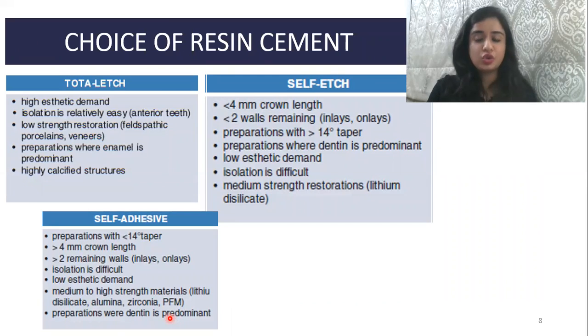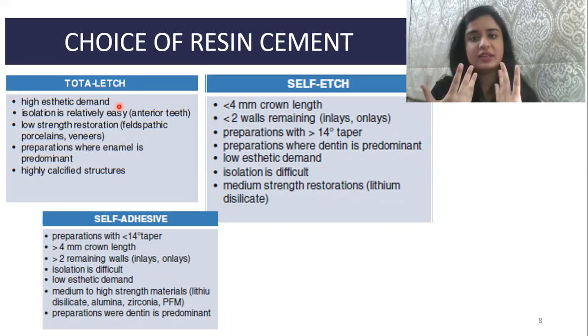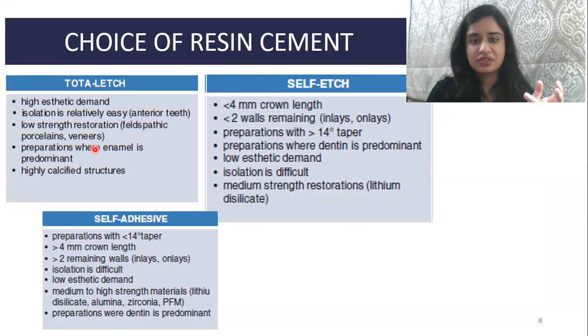Right. Now coming on to the choice of resin cement. So total etch, when there is a high aesthetic demand. So when will there be high aesthetic demand? When we are doing anything in the anterior teeth. And isolation is relatively easy, because it's a technique sensitive procedure. Then low strength restoration, because this kind of cement is a high strength cement, so we can use it with a low strength restoration. So that is your feldspathic porcelain or veneers. Preparations where enamel is predominant. This is very important because etch and rinse is going to bond best with the enamel or highly calcified structures.